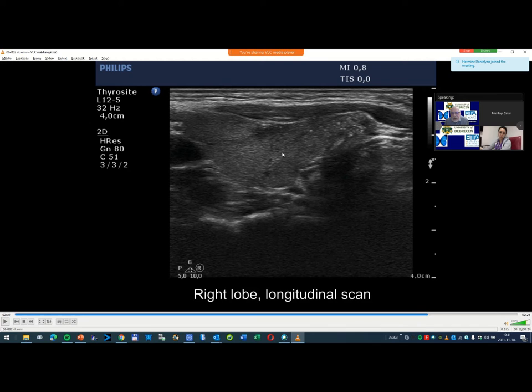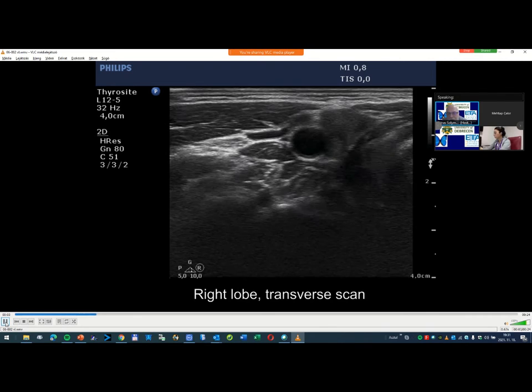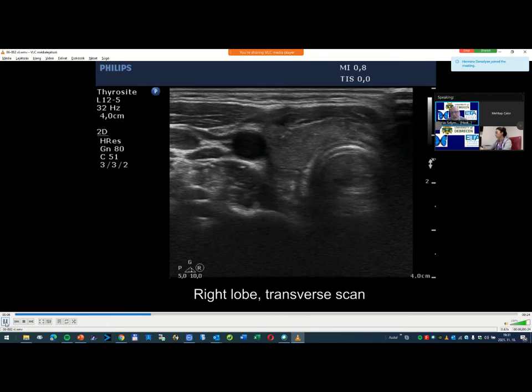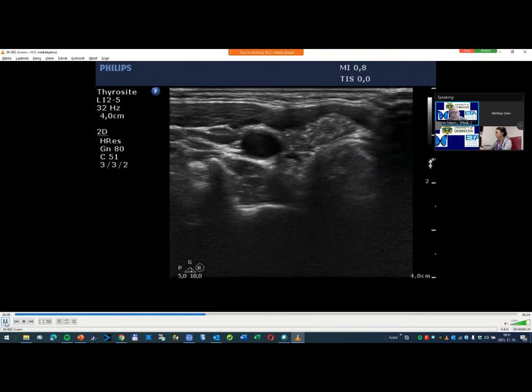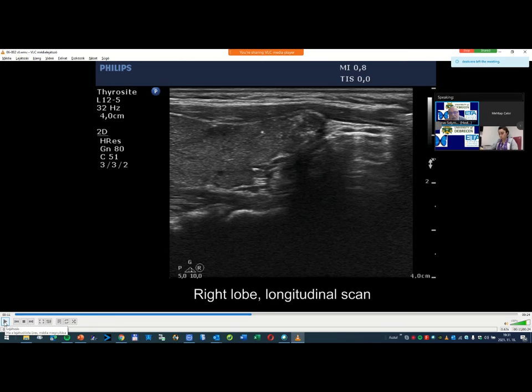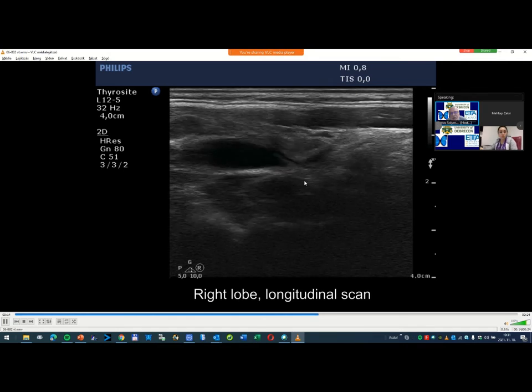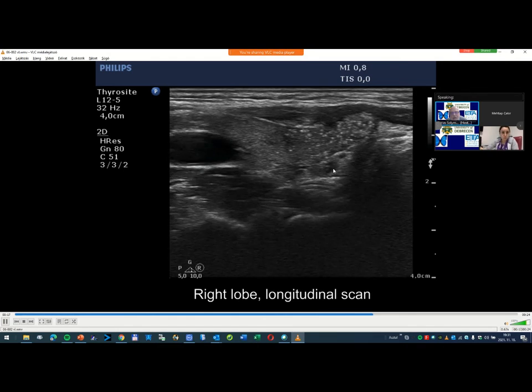This nodule also had lobulated margins. It is very hard to find a good expression of such shape and border of nodules. We cannot be fully sure where this nodule starts and where it ends — it is an absolutely irregular presentation, but we have no words for it. A classical lobulated margin refers to those nodules which are clearly separated from the normal parenchyma, but this one invasively invades this part of the thyroid. I don't know where it starts and where it ends.